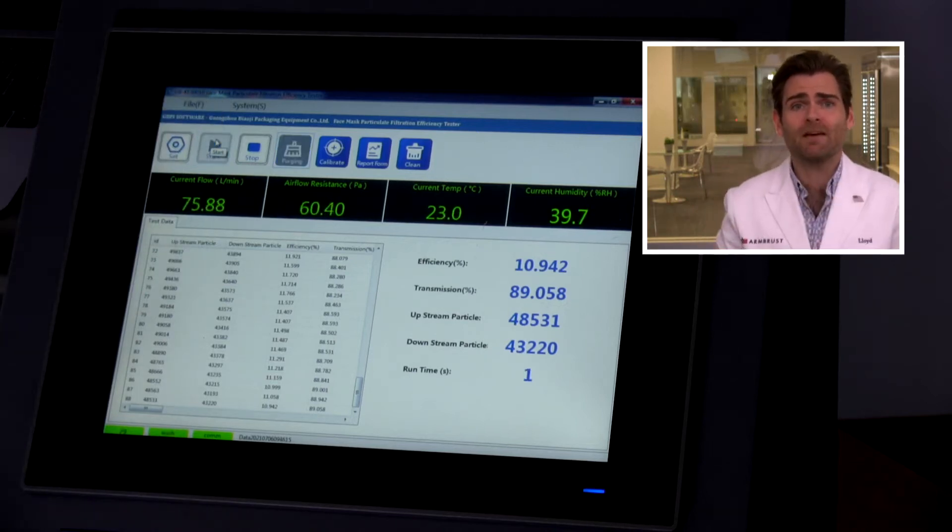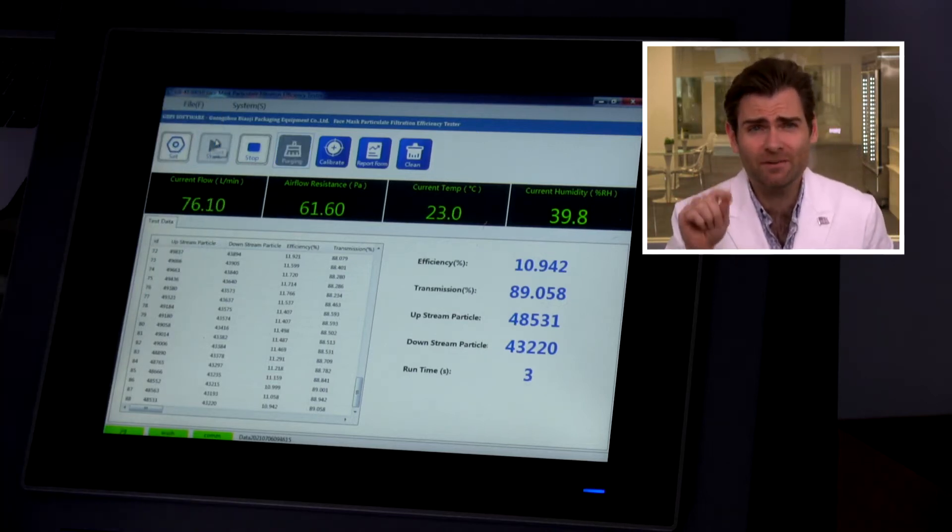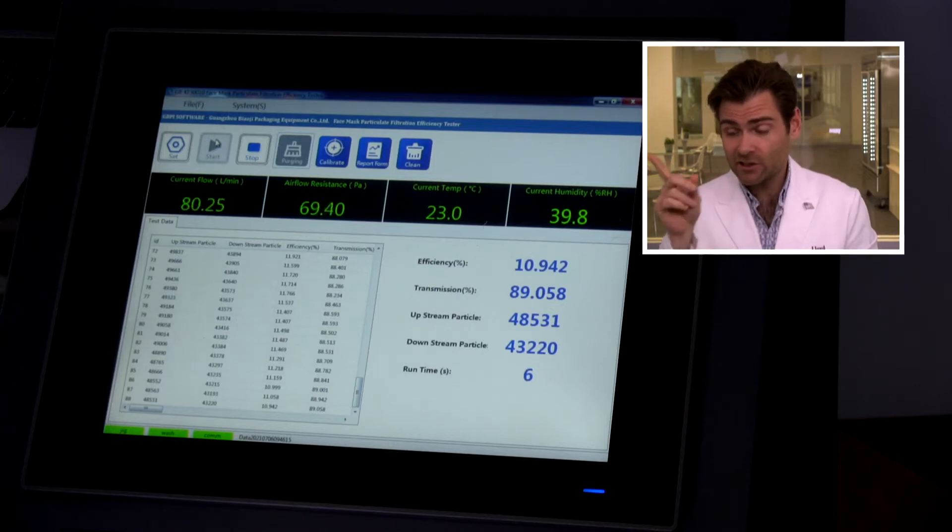This is a PFE machine — Particulate Filtration Efficiency machine. If you want to find out what that is, check out the link. We are just testing the fabric here, we're not testing the fit. Both fit and filtration are important, but your mileage is going to vary on fit.